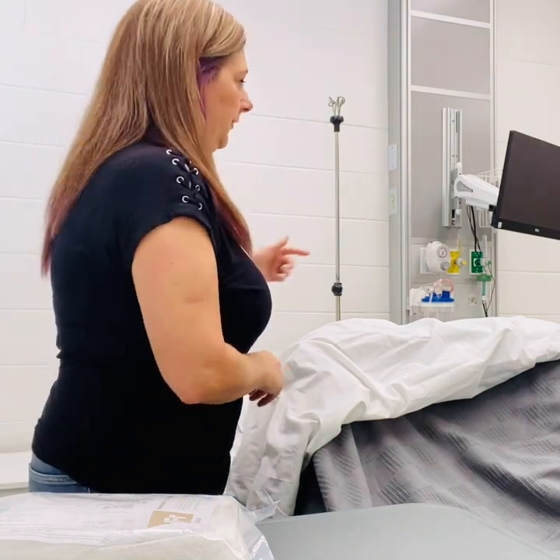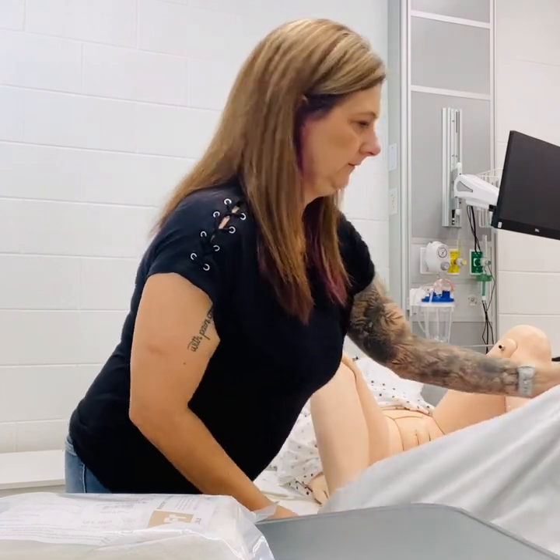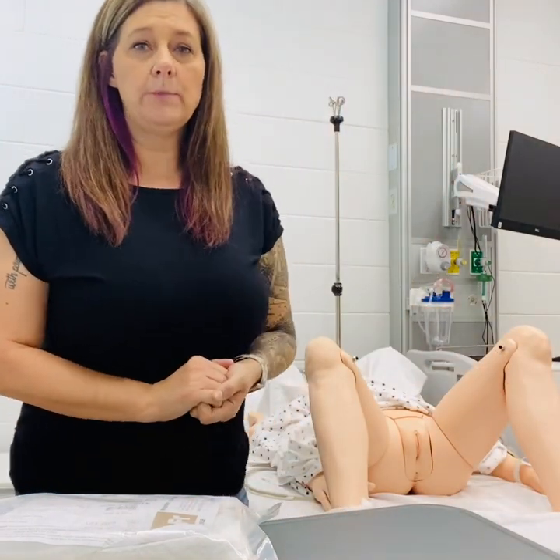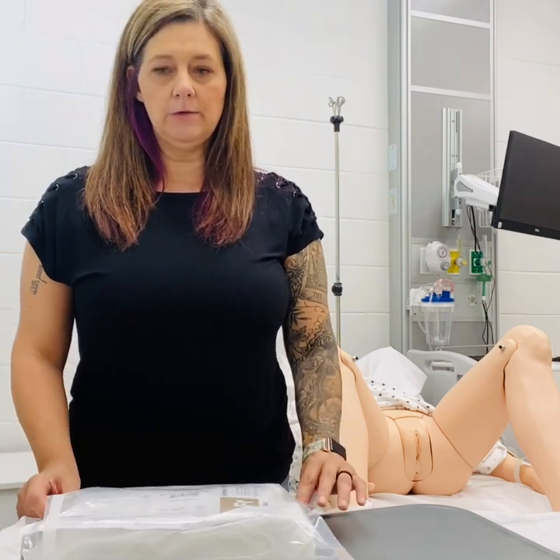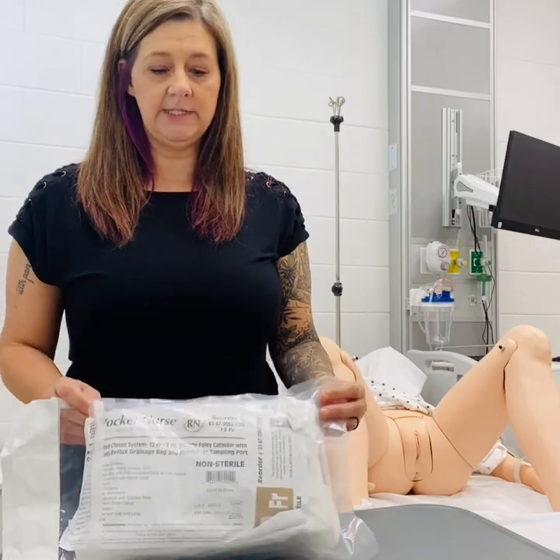We want our patient laying in supine position with their legs abducted and outward. If your patient is unable to cooperate or understand, you may need to ask for assistance for this procedure. Foley catheter insertion is sterile, so we always want to remember to remain sterile during the procedure.